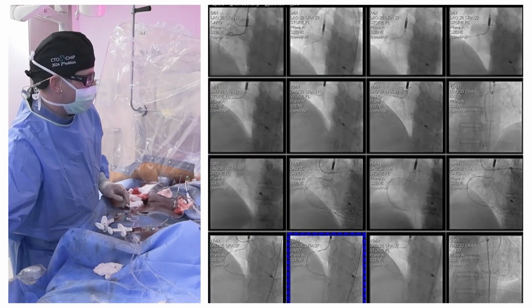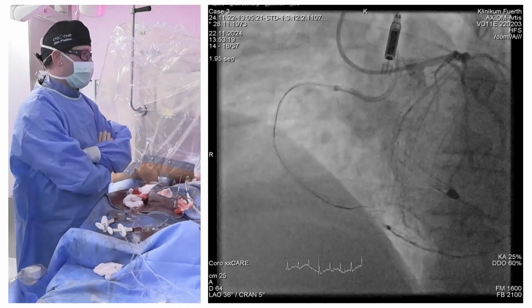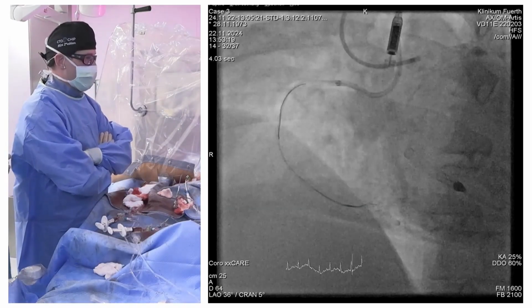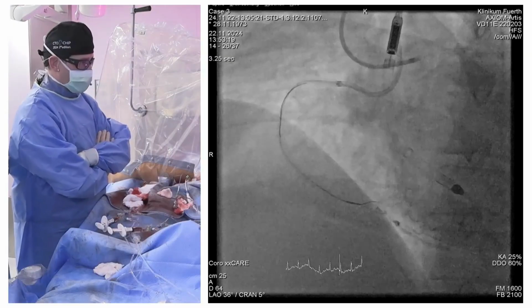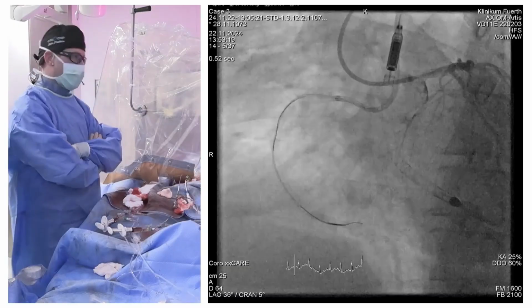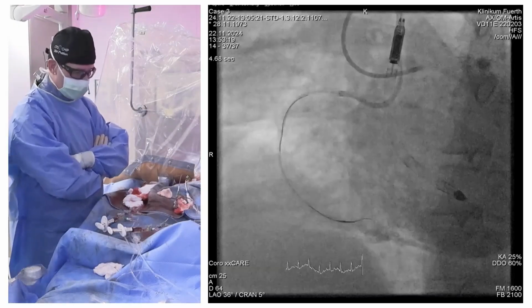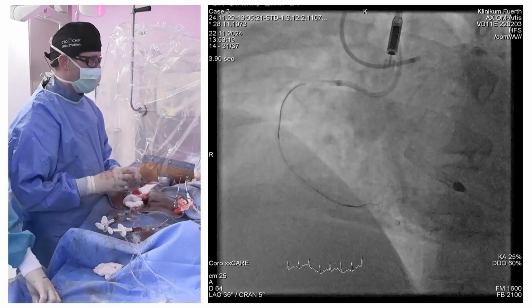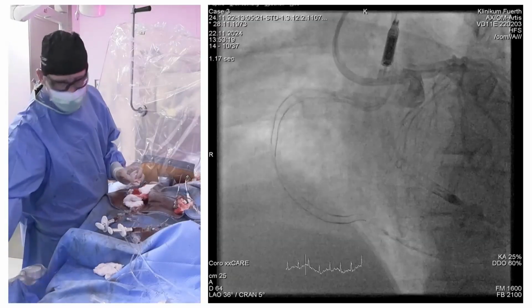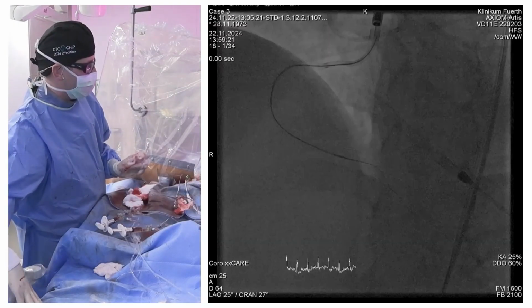This is the RCA, and we are leaving the stent, or basically below the stent. There's a kink in the stent, and we were not able to resolve this, not with any wire, and it was very, very hard. We tried a parallel wiring with a microcatheter.